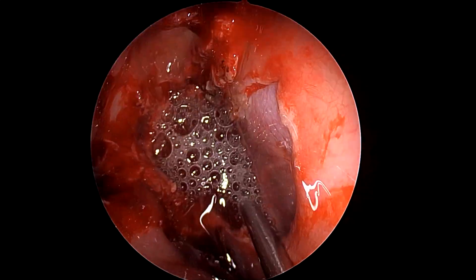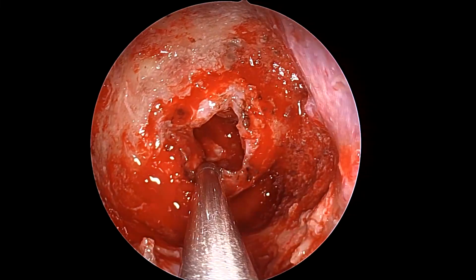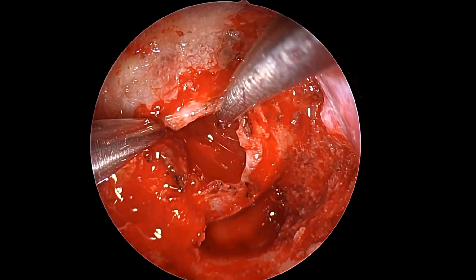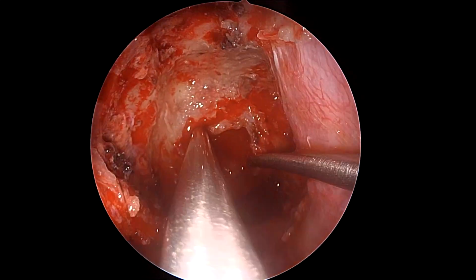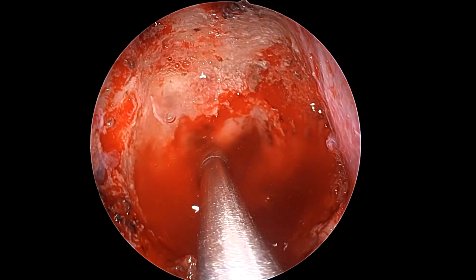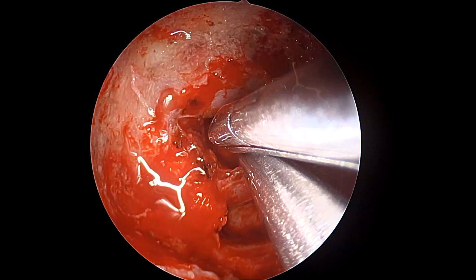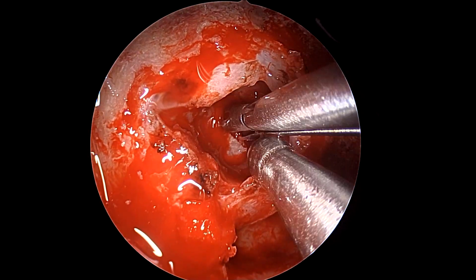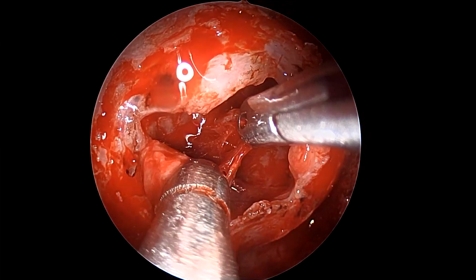One must again be cognizant of the fact that once you feel that the bleeding is a little too uncomfortable for you to have a good look inside, one must use irrigation. One can also temporarily just put a little cottonoid here and wait for 5 minutes. It generally is good enough to settle that, because it's, after all, slight venous ooze. This is not any major vessel bleeding. So one should take time and use frequent irrigation, as well as sometimes we have required cottonoids to be able to visualize better inside before any instrumentation.